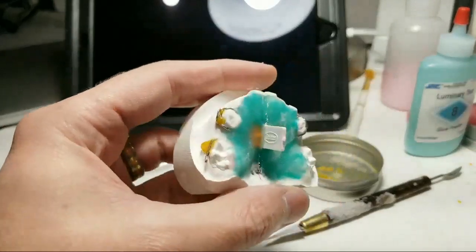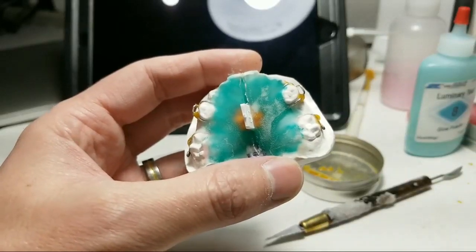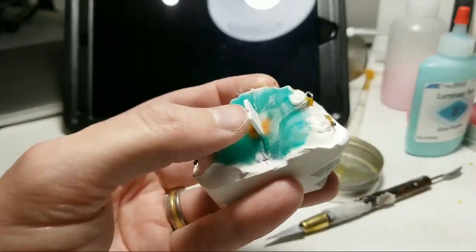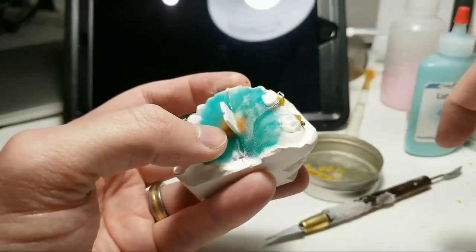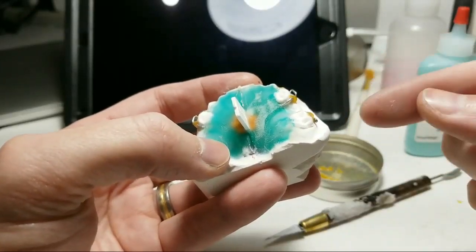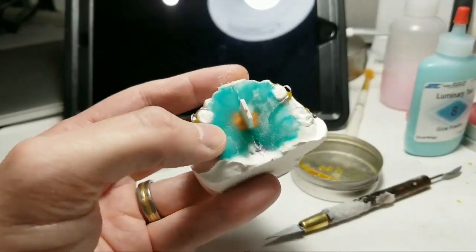Hi, it's me again. As promised, I'm making a video on how to remove this tab. Let me switch the camera around. Here's my Schwartz appliance. I've put the screw in there, as you saw in the previous video — if you missed it, it's probably linked nearby. It's called Wire Wednesday number 23, the Schwartz appliance.